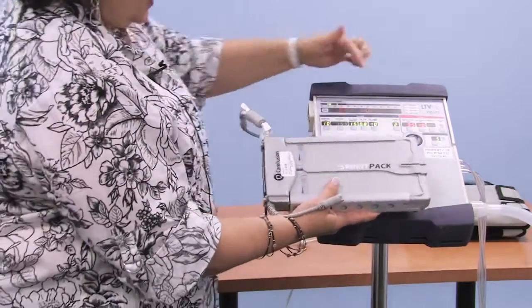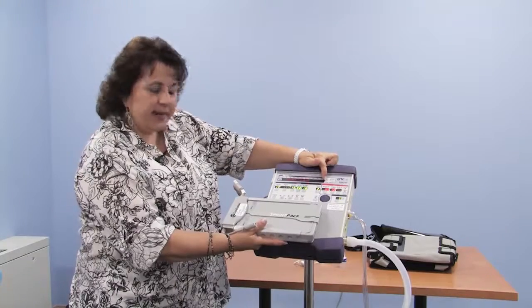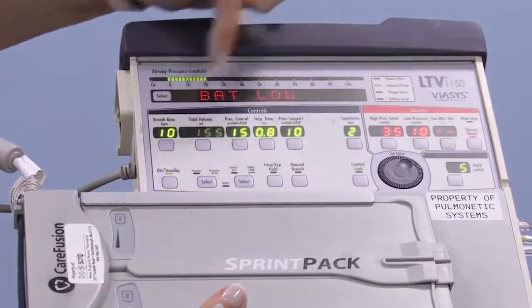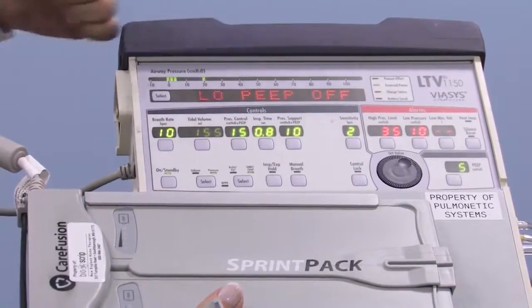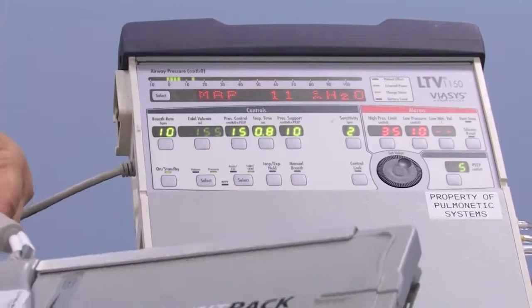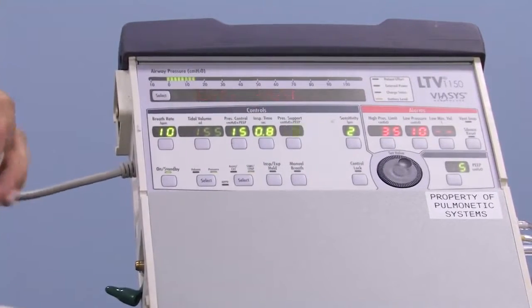You'll notice when I plug it in, the ventilator changes over to external power and is charging the internal battery now. We don't have the battery level on anymore. I can reset this. We no longer have that low. You also might have noticed that it said power lost. When you connect and disconnect power sources from the machine, it also lets you know that you've disconnected something. It's again telling us battery low.